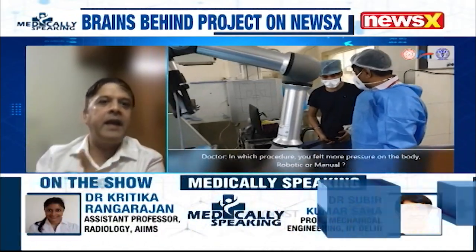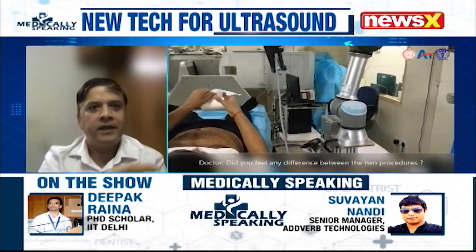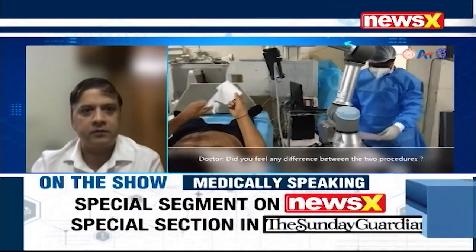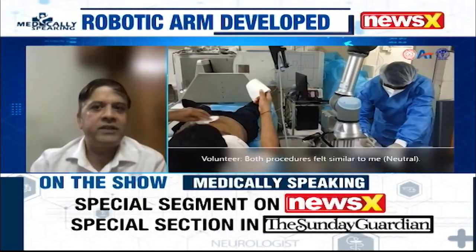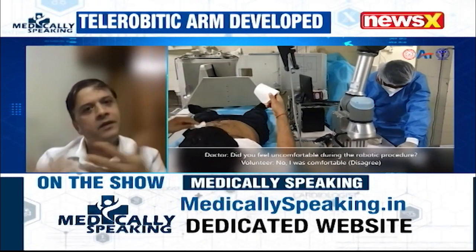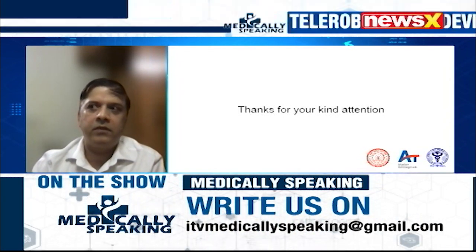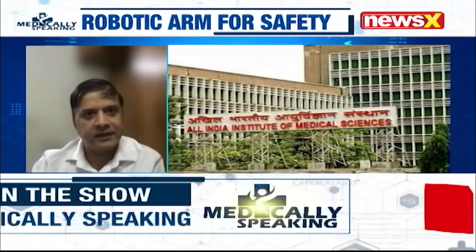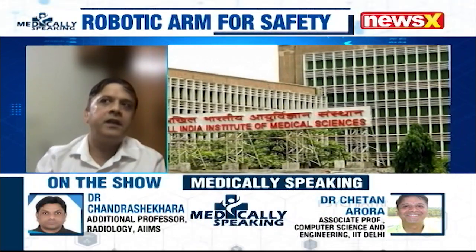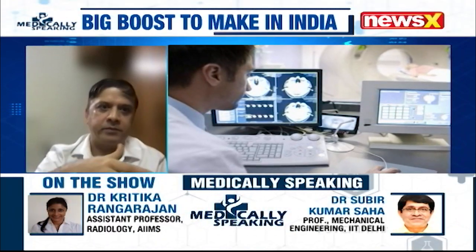So an appropriate amount of pressure can be exerted through the robotic arm on the ultrasound probe, and an appropriate image is captured. This image is then transferred to the doctor's screen. Just like you do a regular diagnosis while looking at the screen and the image, the same way you can do it. So the key issues here are, one, manipulating an arm while sitting at a distance, and the other is transferring pressure and force feedback both ways, from patient to the doctor and doctor to the patient.